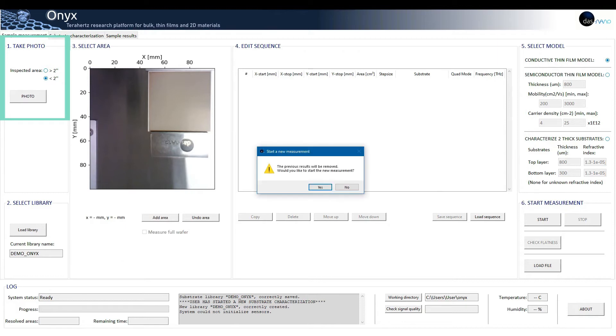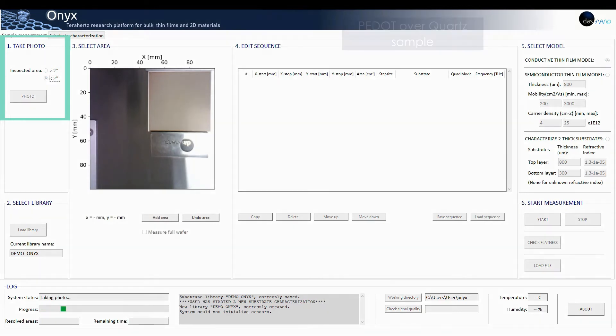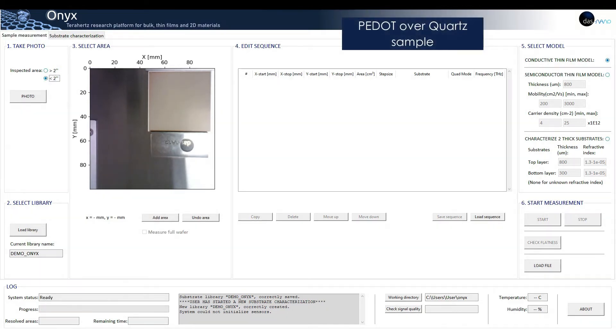As we have done with the substrate, we will take a photo of the sample. Two: select library.